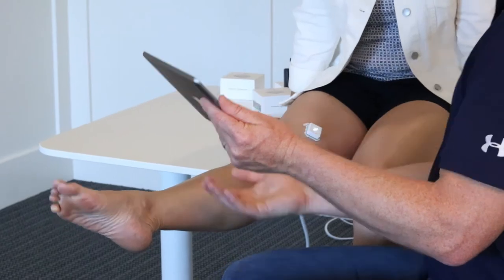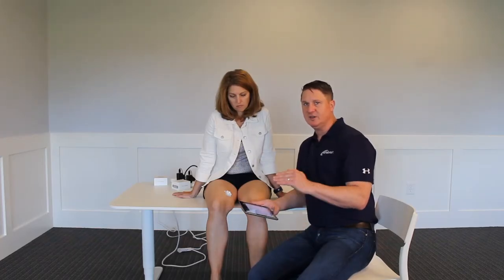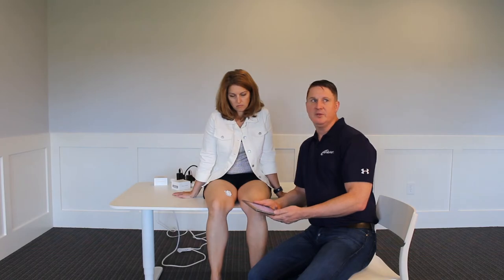It's great for the patient to get the feedback as well. Now we can actually go with the patient and look at the record and see how many microvolts across the 60 seconds. We could obviously establish a baseline with this session, and then over future sessions we could try to set goals and improve upon that baseline, with the end result being a stronger, more stable muscle.